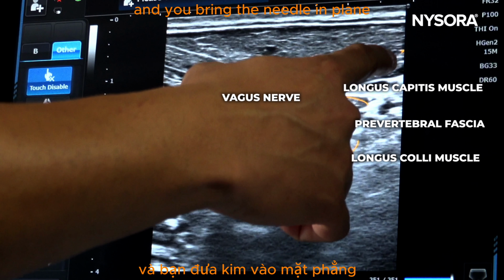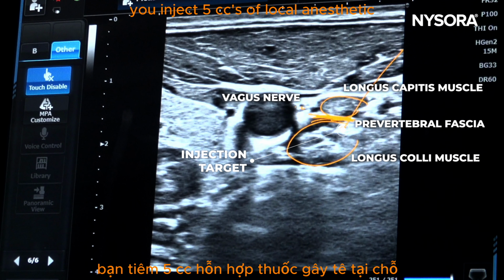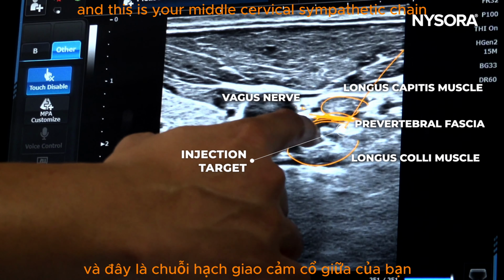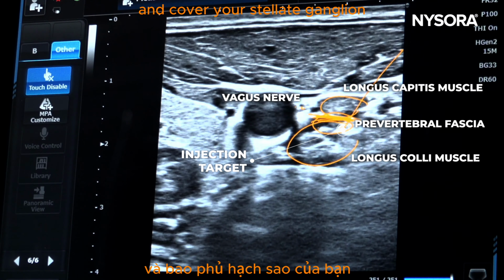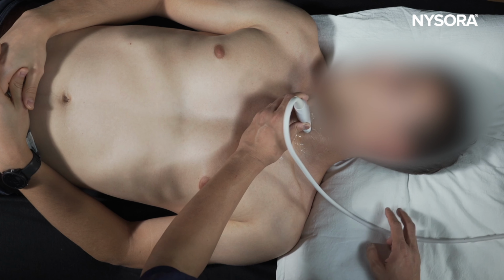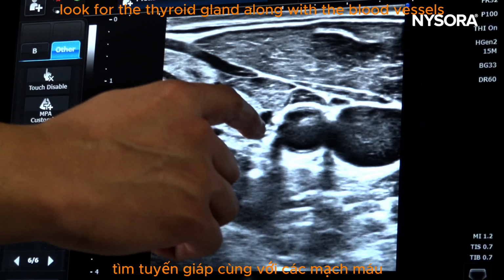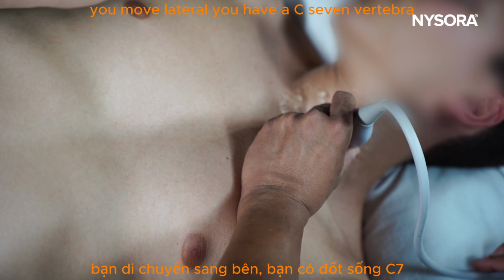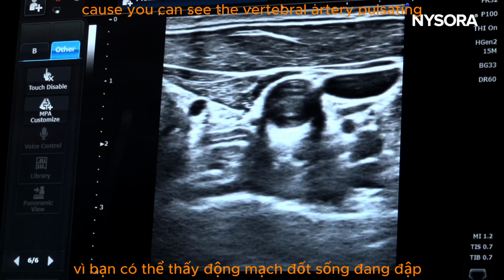You bring the needle in plane, go below the prevertebral fascia, and inject 5 cc's of local anesthetic and steroid mixture, and then you sit the patient up. This is your middle cervical sympathetic chain which you're targeting, but the local anesthetic will flow down and cover your stellate ganglion. So just to recap things again: start at the midline, move lateral, look for the thyroid gland along with the blood vessels. You have the esophagus in that area. You move lateral, you have a C7 vertebra, because you can see the vertebral artery pulsating.